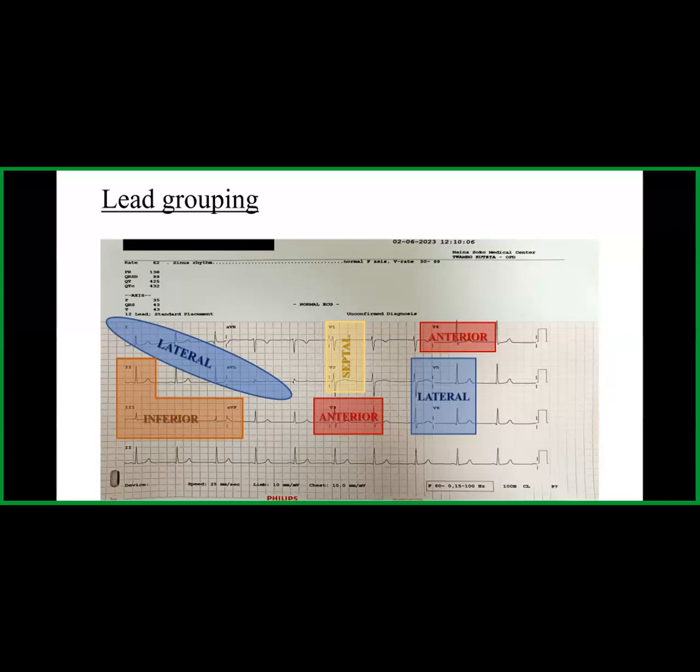We have V3 and V4, which are anterior leads, so they pick up the signal from an anterior point of view.